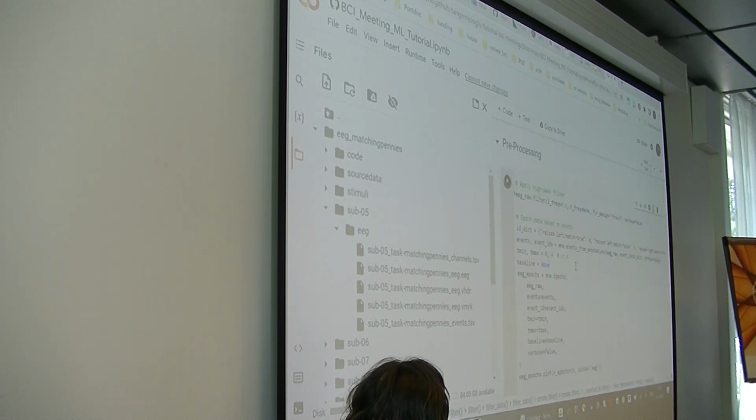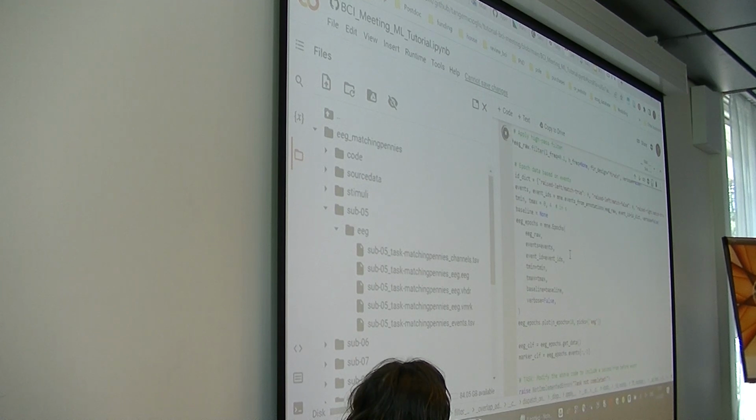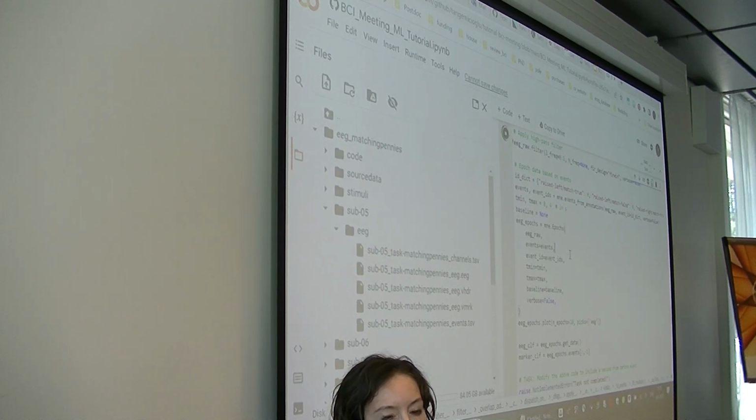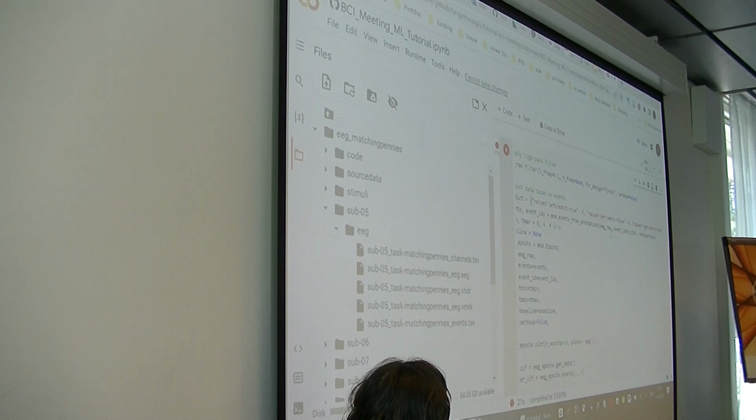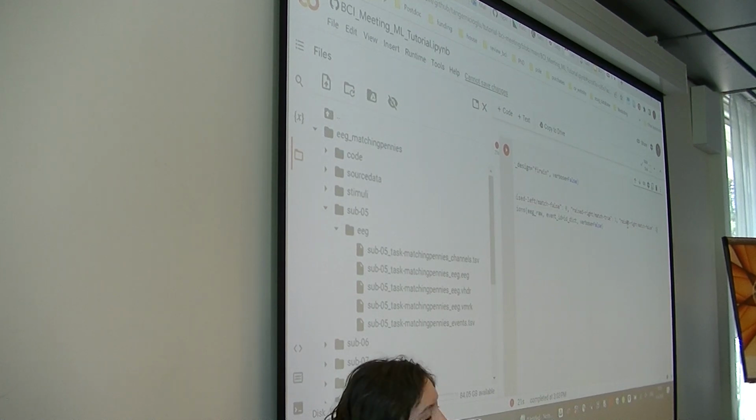So now I'll run this, and we can also walk through the rest of the data. MNE also uses epochs, which are the data separated by each event in the marker stream. Here we are converting some of their events to be the same thing. So we are treating both of the raised left hand ones as the same event, and also both of the raised right ones as the same event, because we only want to classify between the left hand and right hand.